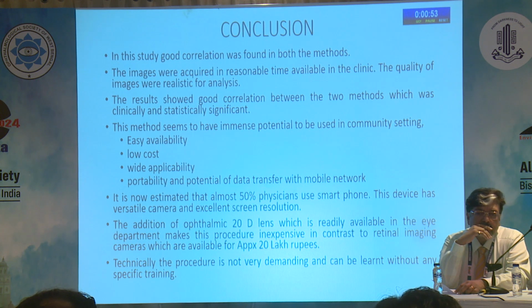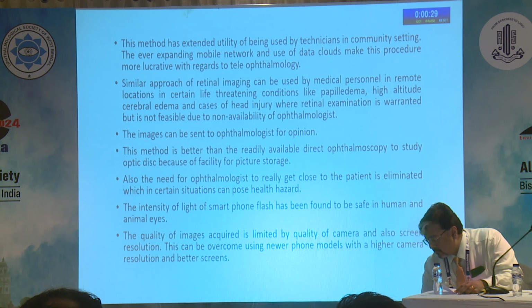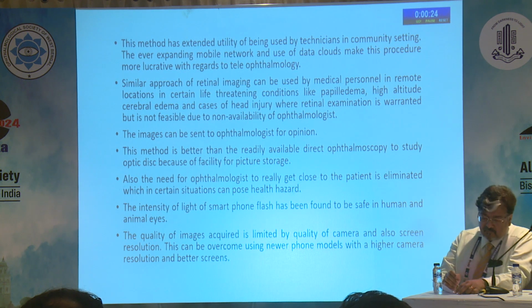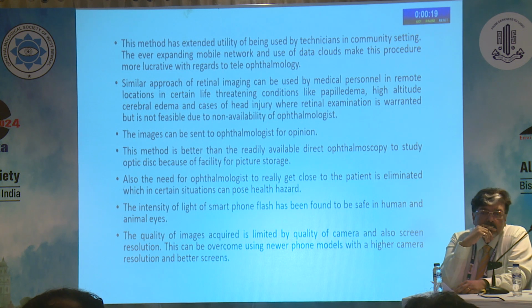It is now estimated that almost 50% of physicians use smartphones. This device has a versatile camera and excellent screen resolution. This method has extended utility of being used by technicians in community settings. The ever expanding mobile network and use of data clouds make this procedure more lucrative with regards to teleophthalmology. A similar approach of retinal imaging can be used by medical personnel in remote locations in certain life-threatening conditions like papilledema or high-altitude cerebral edema. The images can also be sent to ophthalmologists for opinion.